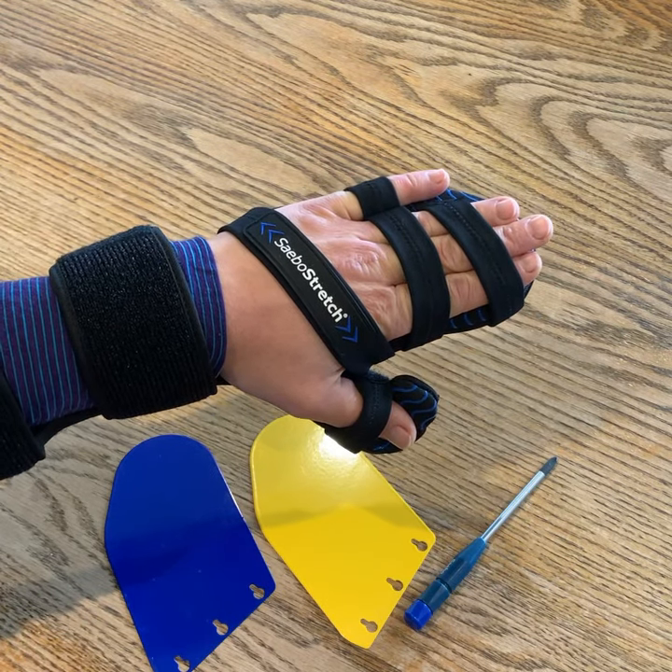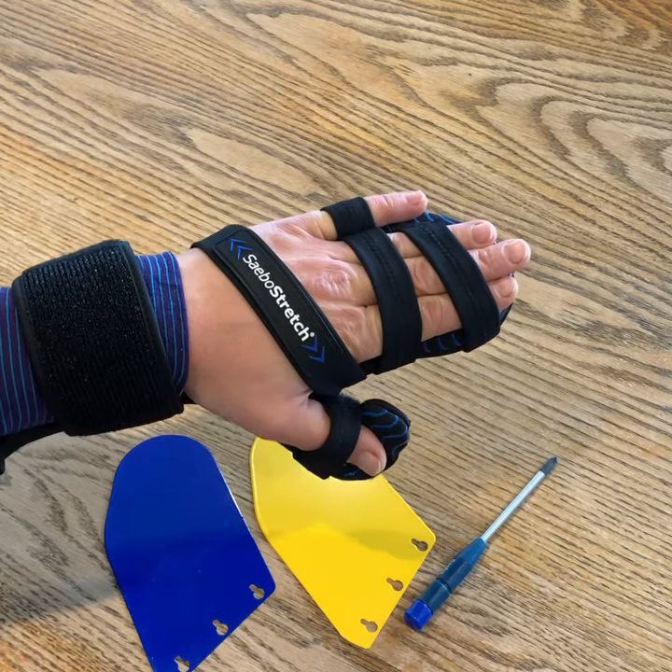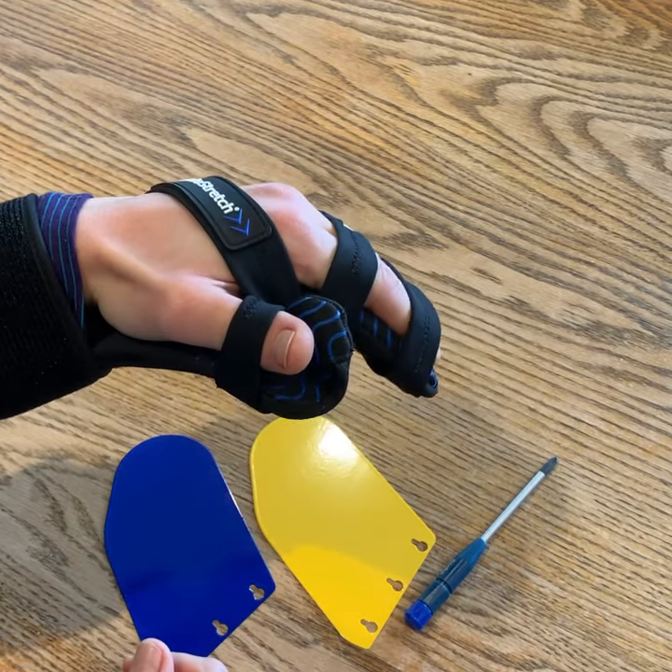In this video I'm going to show you the unique features of our Sabo stretch resting hand splint. The key design that makes this one different is the dynamic hand piece.